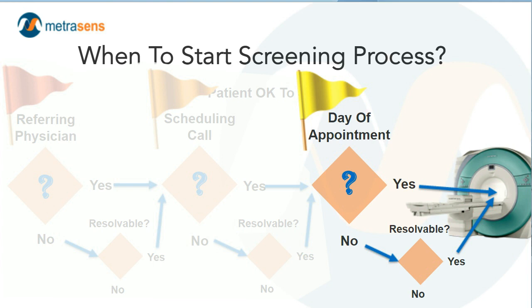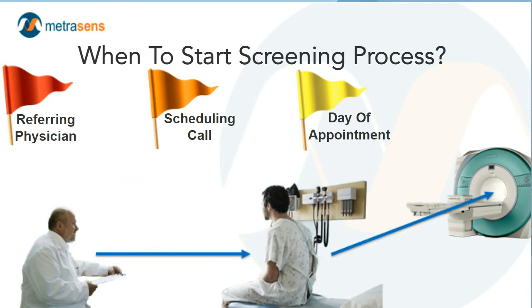We don't often think of the referring physician having a direct role in MR safety and MR patient screening, but this was a lack of imagination on our parts. The referring physician is the person who probably has the greatest access to the patient's medical record, medical history, certainly more so than the radiologist or technologist on the day of the study.